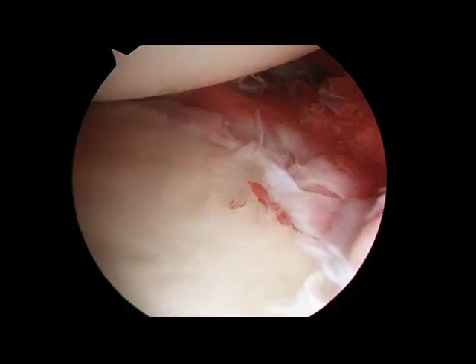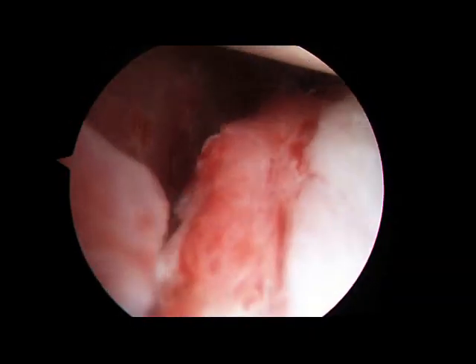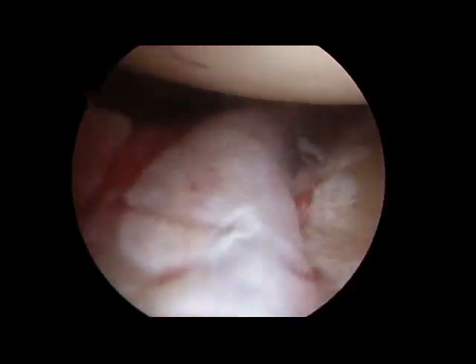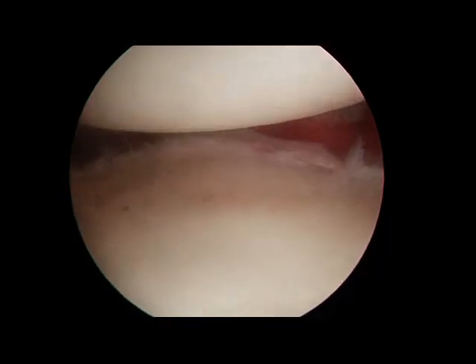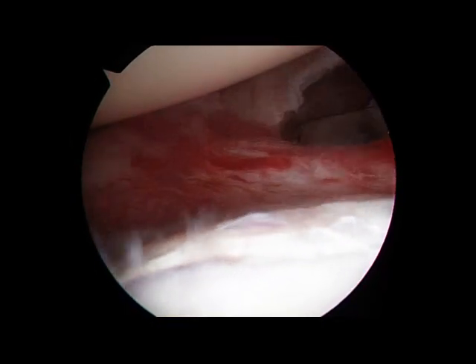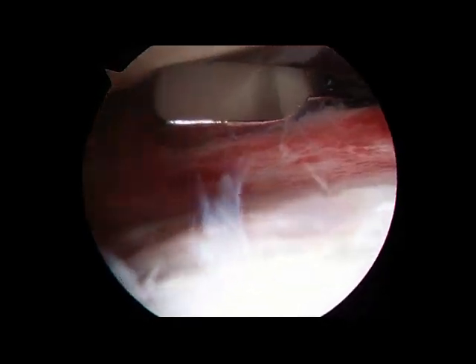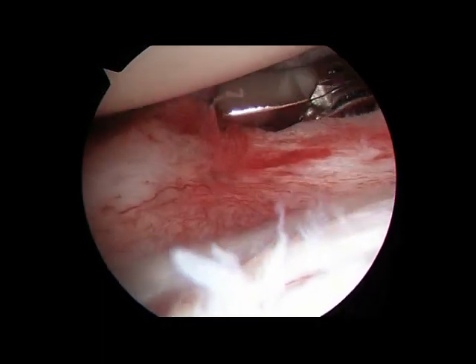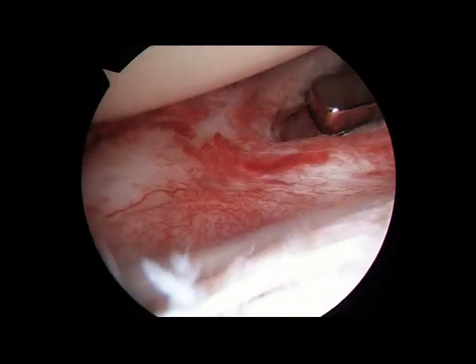We're going to go ahead and remove some of this to cause a nice full release all the way around. As you're looking at the back of the shoulder, look at all that red synovitis right there. What we're going to do is start to release some of this capsule and then explore the rest of the shoulder in just a second. What we did earlier is manipulation — we're just trying to complete the capsule rent, getting all the way around the shoulder, being very careful to stay between capsule and muscle.